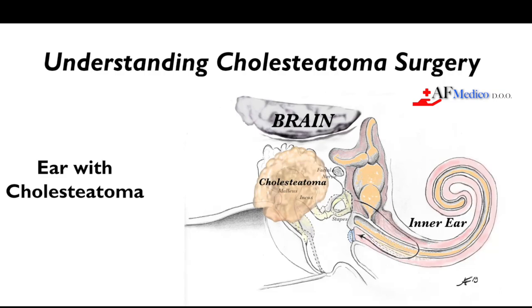Today, I'm going to show you a series of videos that discuss the management of cholesteatoma. First, I'm going to show you a video of a discrete attic cholesteatoma resection using the posterior tympanotomy as well as a transcanal exposure, ending up with a nice intact canal wall reconstruction.